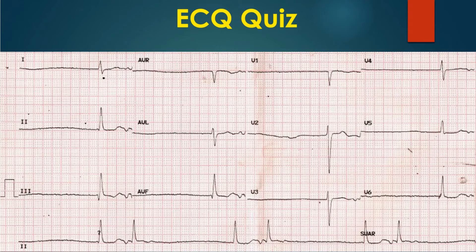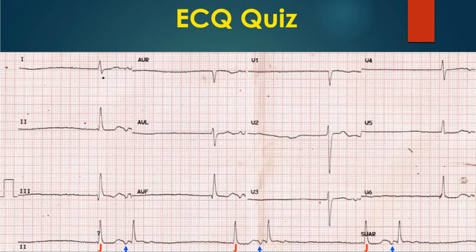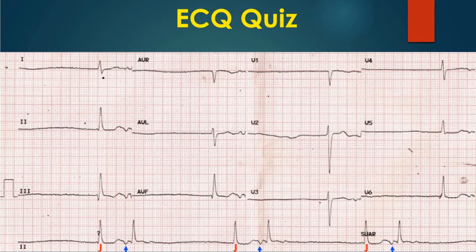Here is another ECG with bigeminal rhythm. What is the diagnosis? The beats marked as J are junctional escape beats occurring at a slow rate. They are followed by inverted p-waves in inferior leads prior to the next QRS complex, marked by the blue upward arrows. These beats could be either beats originating from the low atrium, i.e., coronary sinus rhythm, or from the high junction.